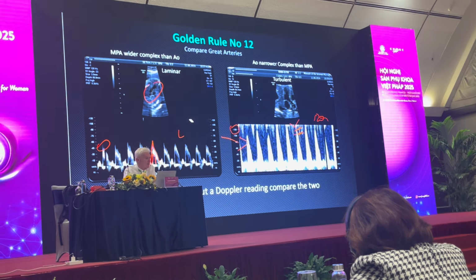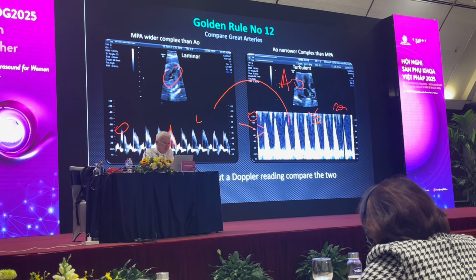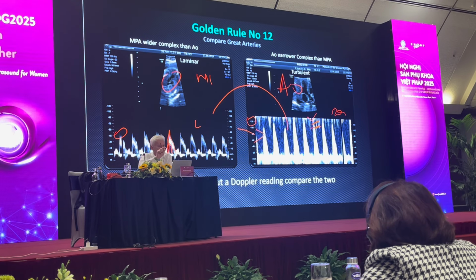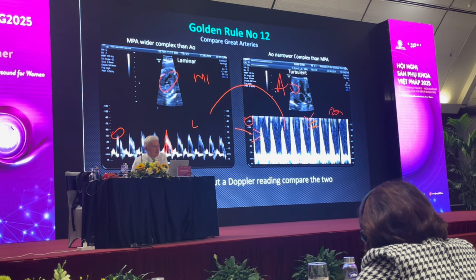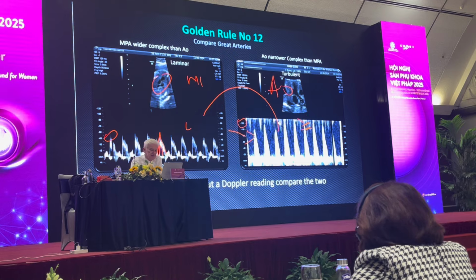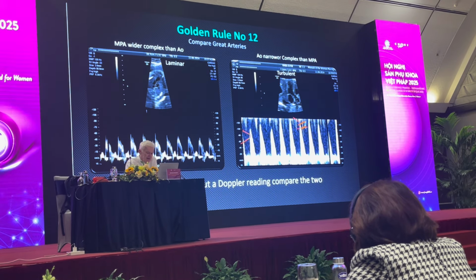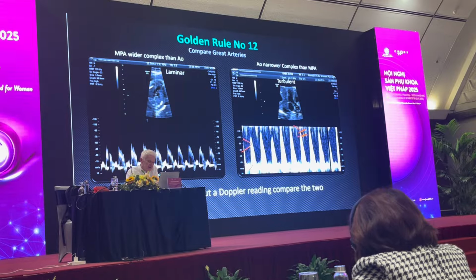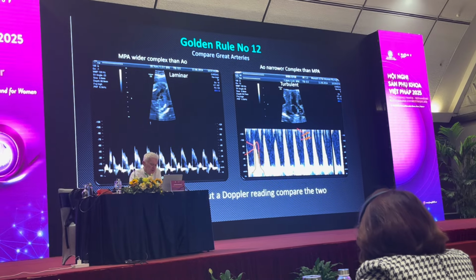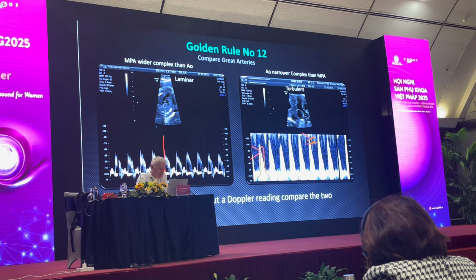And now I am confident, because I am comparing the aorta with the main pulmonary artery, jumping the Doppler gauge from one vessel to the other. I now have certainty. And also, which is very subtle, and if you are an experienced operator, you will realize that the rate of rise is slow in aortic stenosis. Whereas if you've got normal, your rate of rise is straight up.